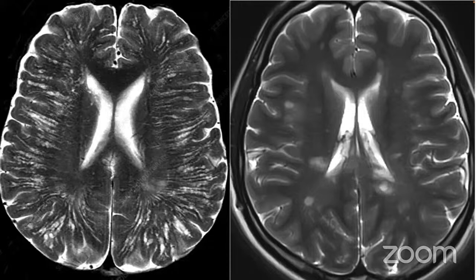teaching about the white matter lesions, focal white matter lesions, but just to at least give a note on that. So if you can see, all the MS lesions follow one of these radial patterns in the white matter tract. It is oriented within a specific design, and it's not haphazard.